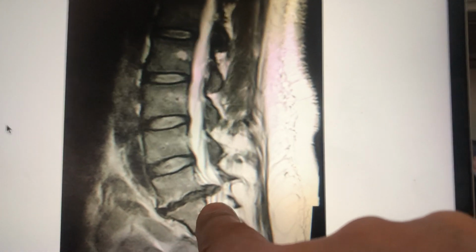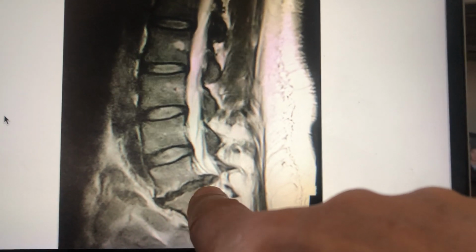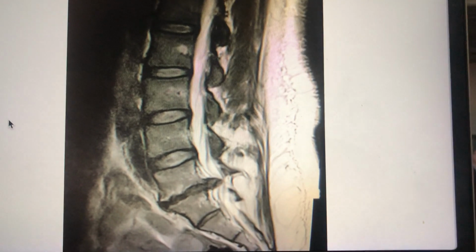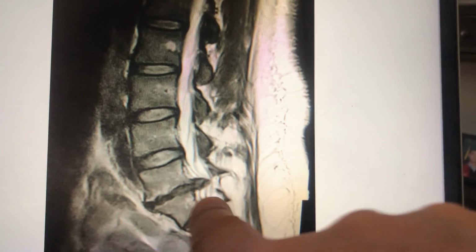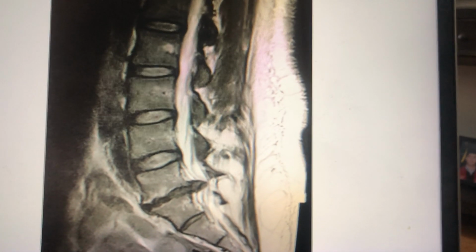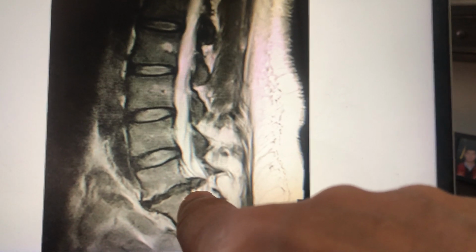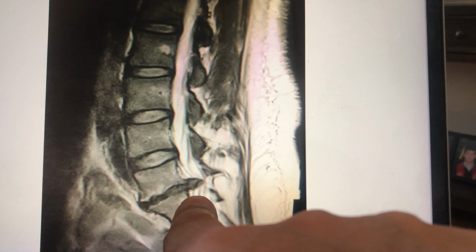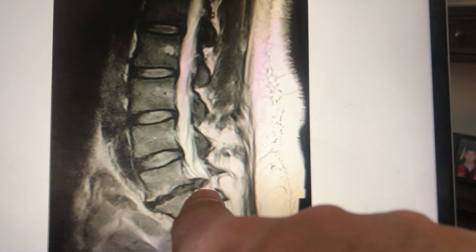This MRI scan is only about a month old, and if you were to take an MRI scan of this person, say 2 months ago, there probably was a good deal of this present already, but it wasn't symptomatic, as it sometimes is not in some patients for quite a while, but it's very symptomatic now. It's very reasonable to do surgery if this was incapacitating, or it ruined her quality of life and she wasn't patient with the process and the pain was too much. That would all be a reasonable cause for taking out this disc in what we term a discectomy surgically.